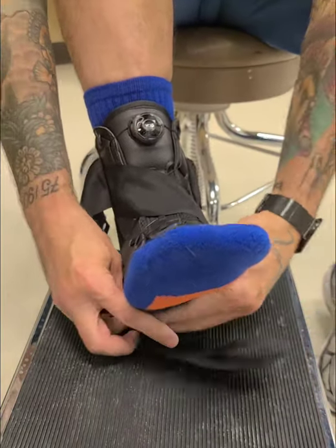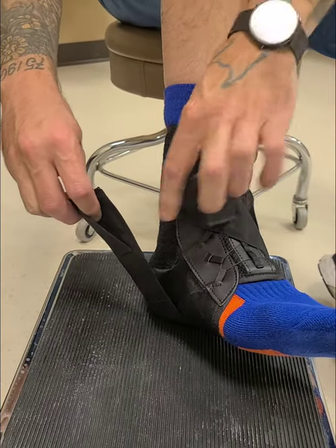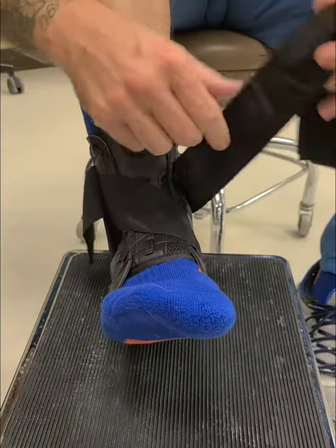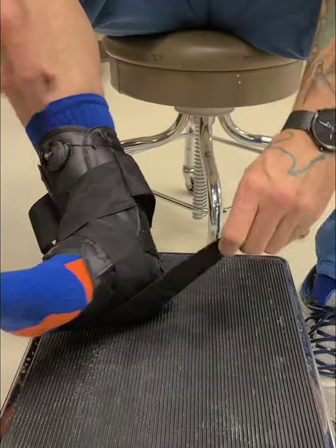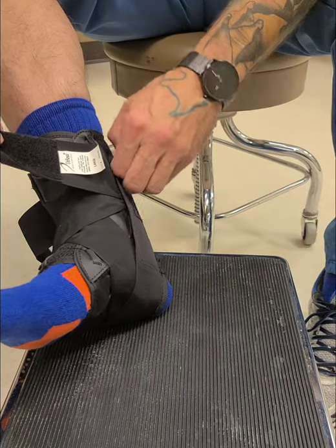You go over the foot, underneath the arch and heel, and then on the other side you have to move the strap out of the way — there's a velcro strip. You pull it and lay it flush right on that velcro strip. Same thing on the other side: go over the foot, under the arch, and over here there's a velcro strip. Move this out of the way and lay it down on there.